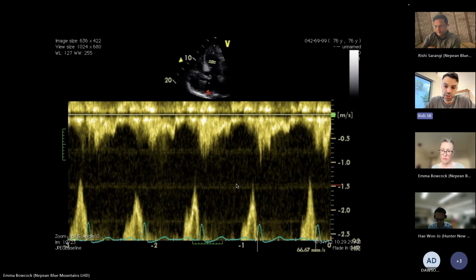And in this image alone, depending on what you wanted to look at, you would increase your sweep speed so that you have fewer cardiac cycles per image. Does that help with aliasing though? No, sorry, I misunderstood. That won't help with aliasing. It'll just help optimize your picture.